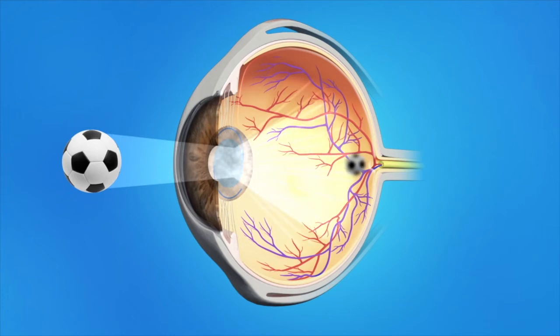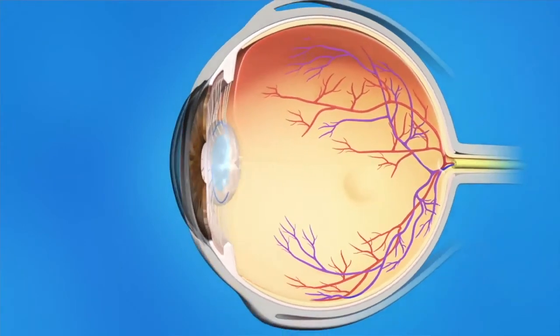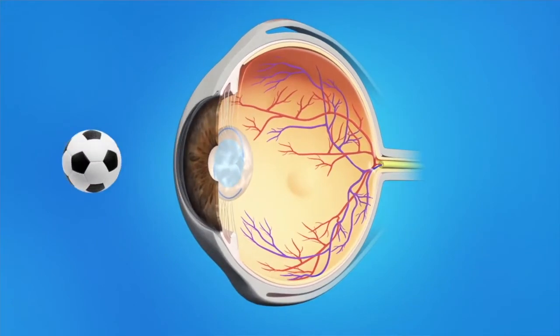This has to be done at least 3 months after the surgery, but could be needed months to even years after surgery. It's quick, it's easy, it's painless, it's done in the office here, but about 1 in 2 or even more, 50% or more patients will need this. Finally, for those looking for vision correction without the need of glasses or contact lenses, some of these advanced lenses are able to do this.